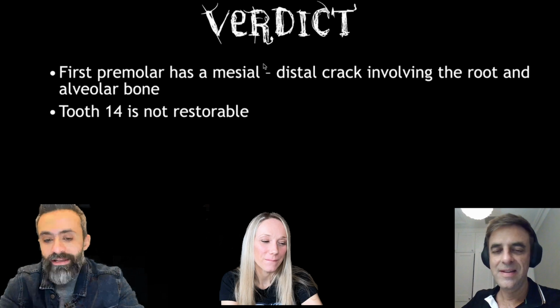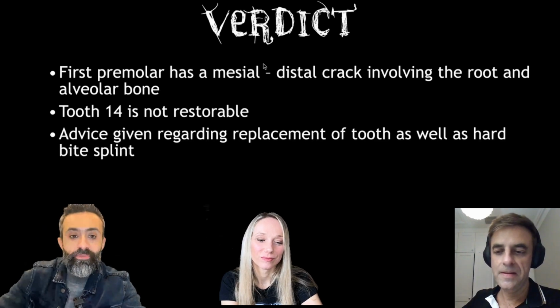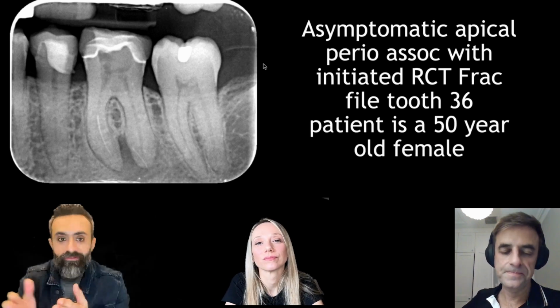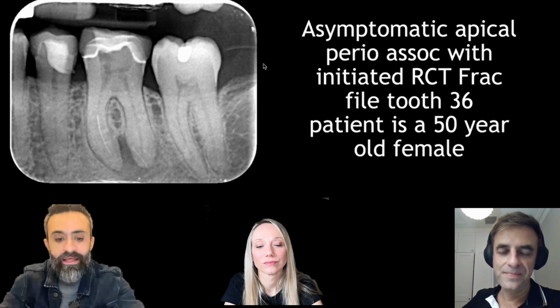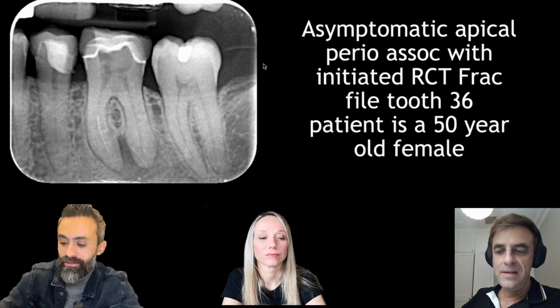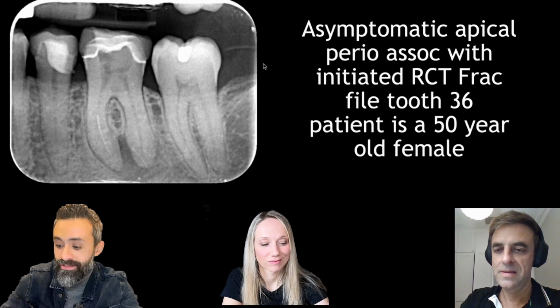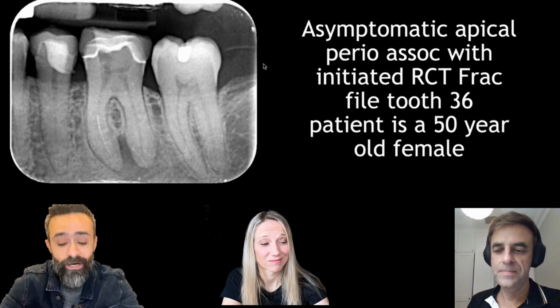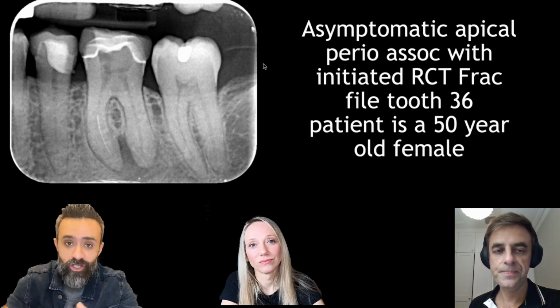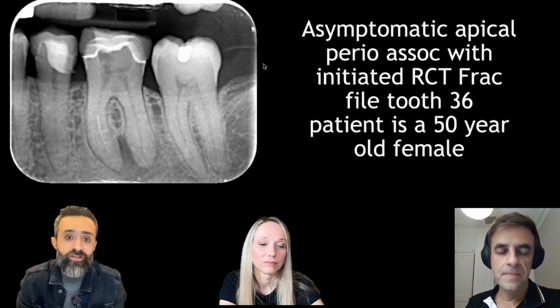So, one of the classic indications for taking a CBCT scan is previous treatment mishaps. We want to evaluate the previous treatments or even initiated treatments with some accidents. And let me be precise about one single mishap or accident, which is separated instruments. We discussed a lot in the previous year of Endocast about that nightmare. So, how can CBCT help the clinician to manage separated instruments, be conservative, or maybe change the treatment plan?